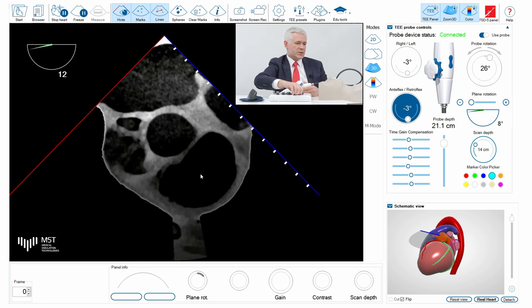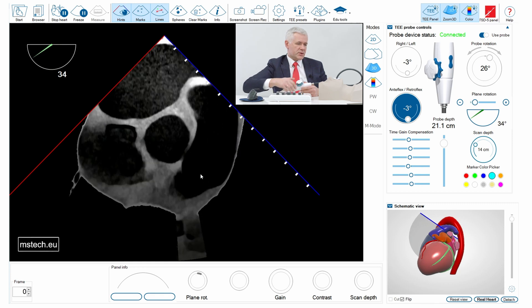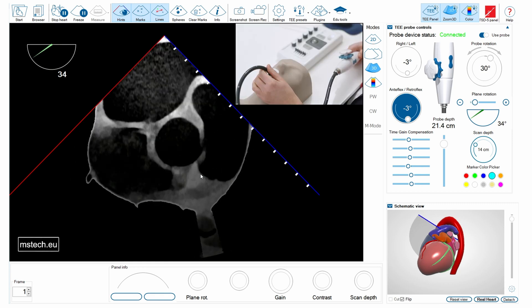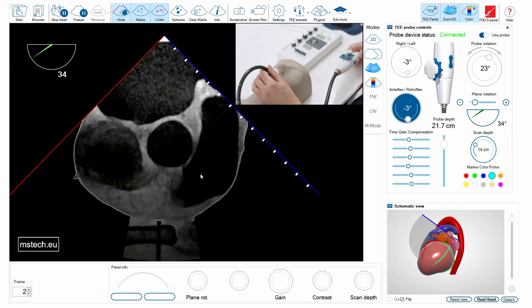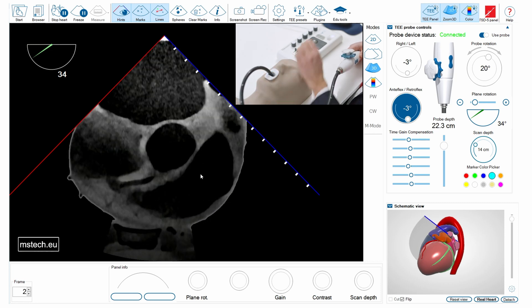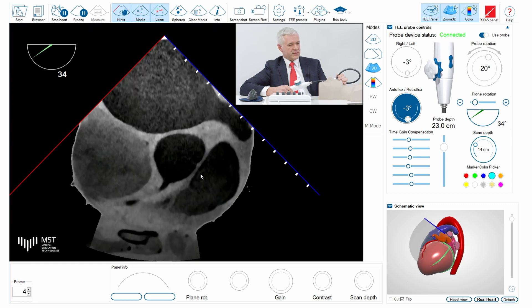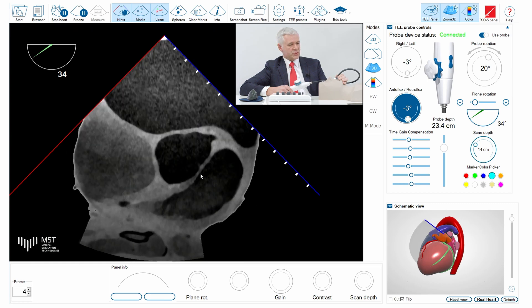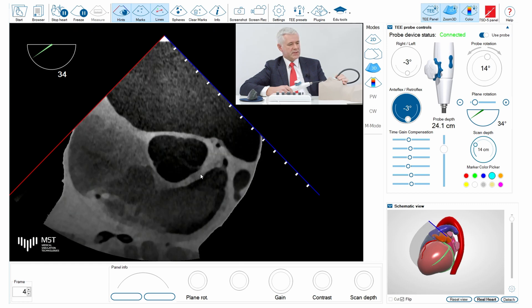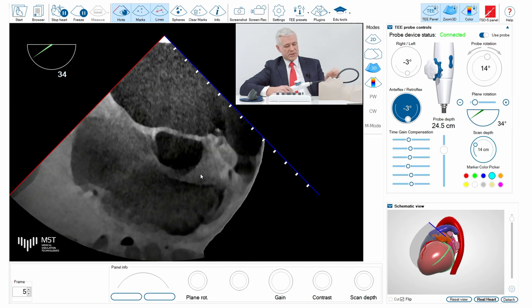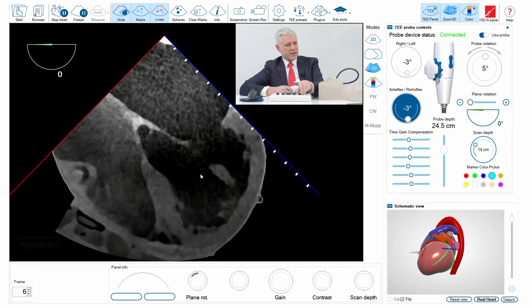To achieve the cross-sectional view of the aortic valve, I rotate to approximately 30 degrees and go down to see more of the aortic valve in short axis with the three leaflets. Since I'm interested in the mitral valve, I go back to zero degrees and go slightly deeper.